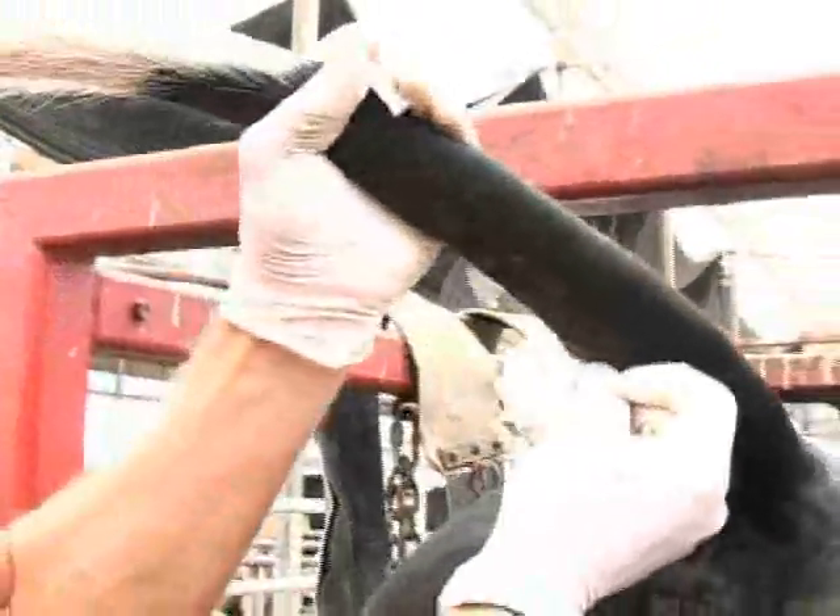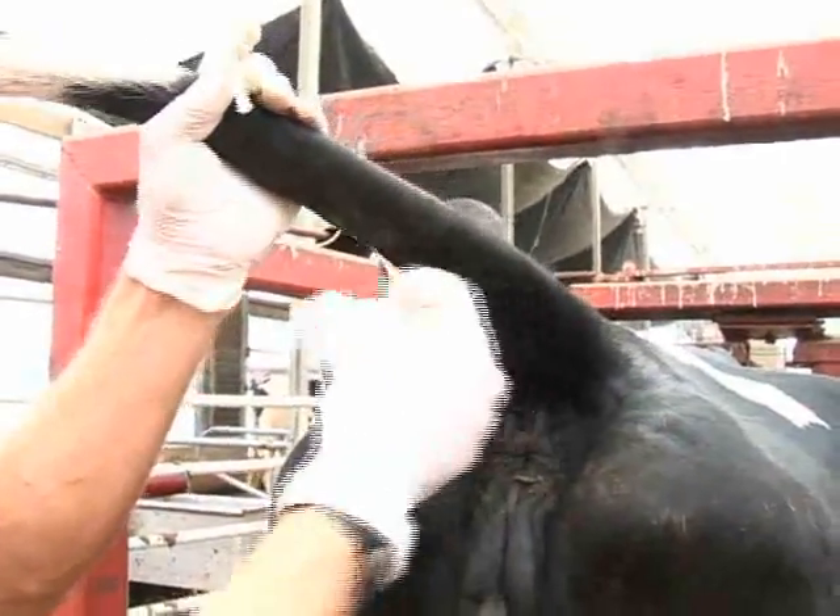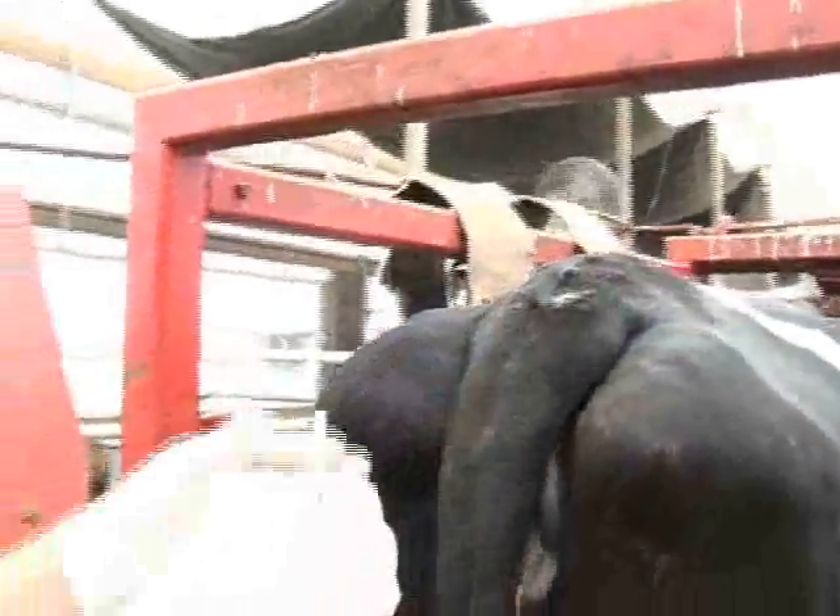Once we're finished, we'll apply pressure with a clean part of the gauze onto the area where we drew blood. We'll then use that blood sample on a test to determine ketone body levels in this cow.